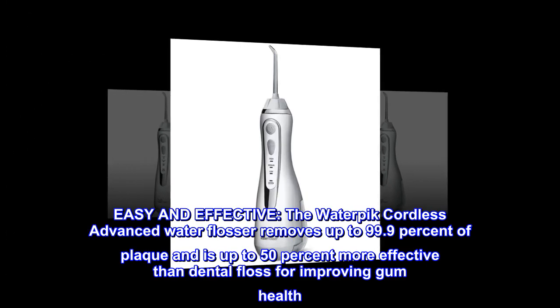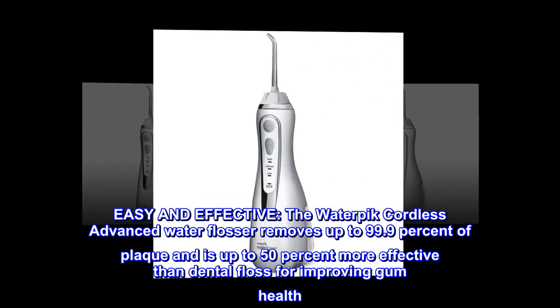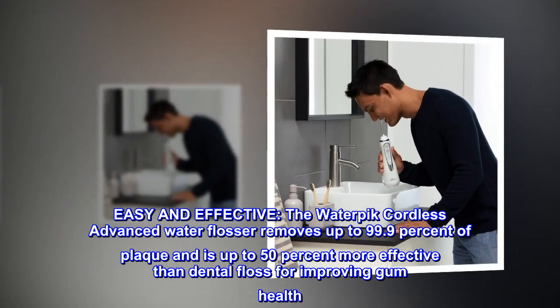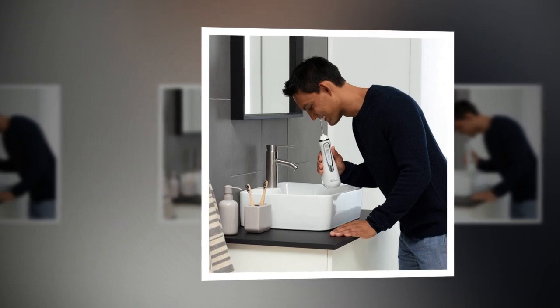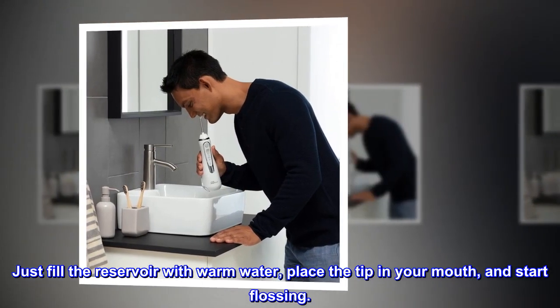Easy and effective. The Waterpik Cordless Advanced Water Flosser removes up to 99.9% of plaque and is up to 50% more effective than dental floss for improving gum health. Just fill the reservoir with warm water, place the tip in your mouth, and start flossing.